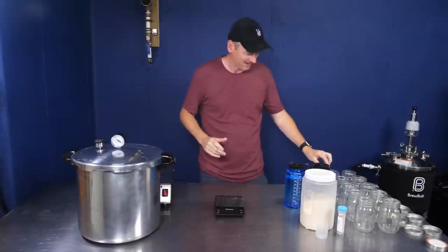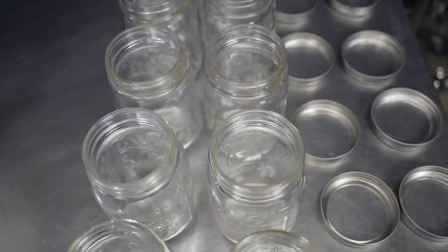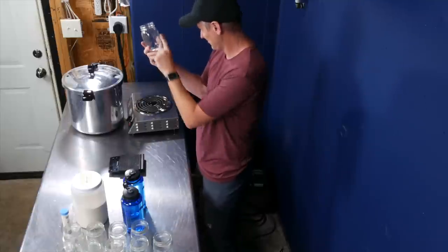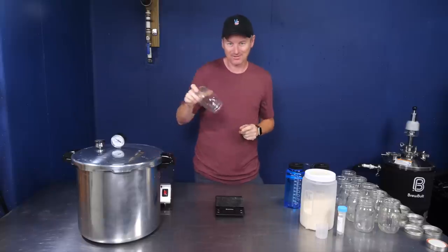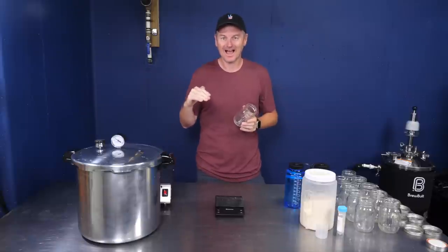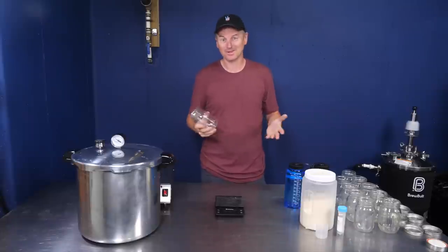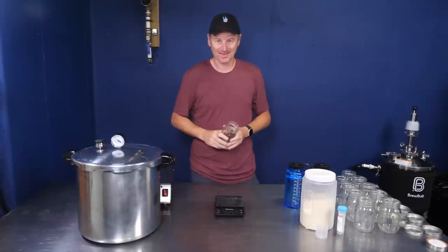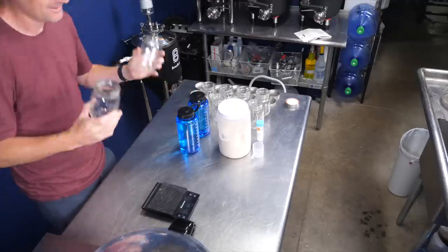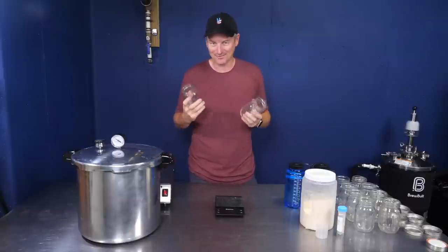In each one of these mason jars, I'm going to create concentrated canned wort. The idea is that when this is made, I'll be able to take the wort, put it into a flask, top up the water to one litre, and have a wort with an original gravity of 1.040, which is ideal for yeast starters. If I want a two litre starter, I'll just use two jars, add water to two litres, and so forth.